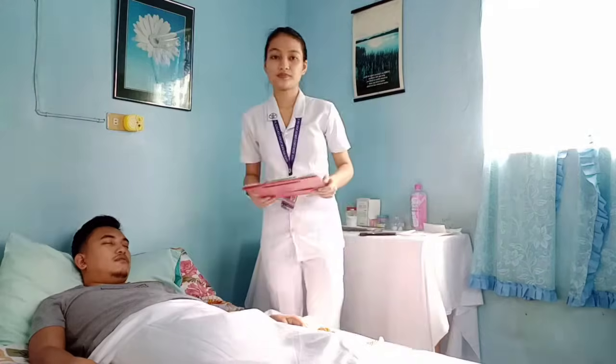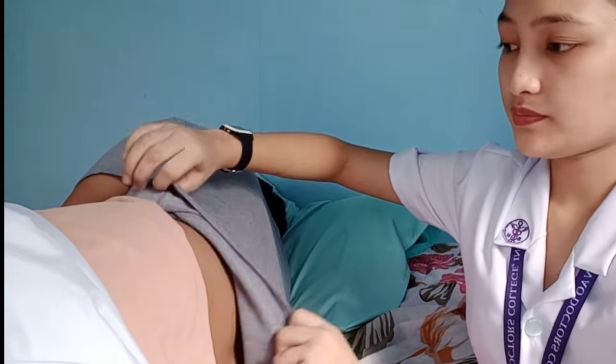Okay, sir. Select appropriate site for injection. Vastus lateralis and deltoid muscle are possible sites for intramuscular injection. Examine the integrity and amount of patient's muscle mass and palpate the muscle area. If there is tenderness, then this site might not be suitable to be an injection site. Inspect the area for bruising, inflammation, and edema. If the skin shows bruises or inflammation, use other sites.